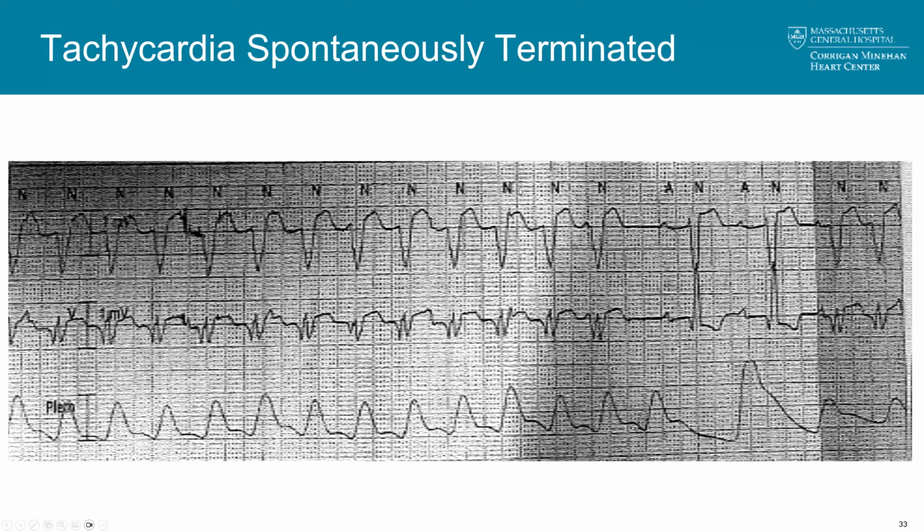And the question here is, does changing the paper speed help? It can, but I would say probably the findings you're looking for should be sufficiently obvious. And I personally would say that when you're dealing with a potentially unstable patient, I'm often working to try to keep things more simple for myself rather than more complicated.